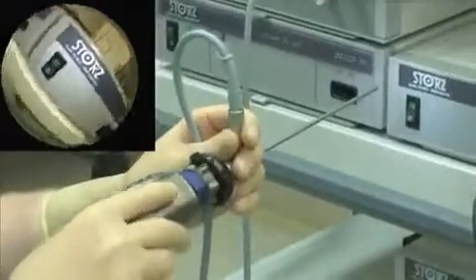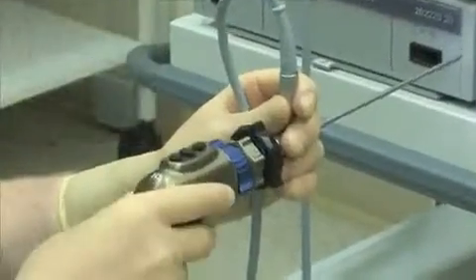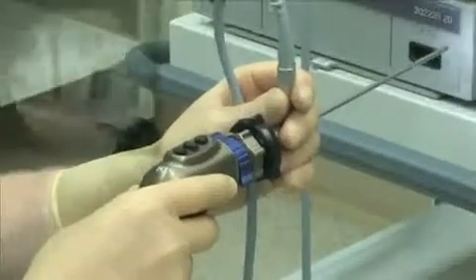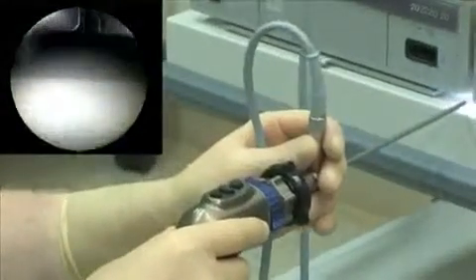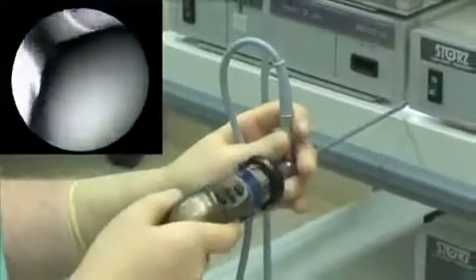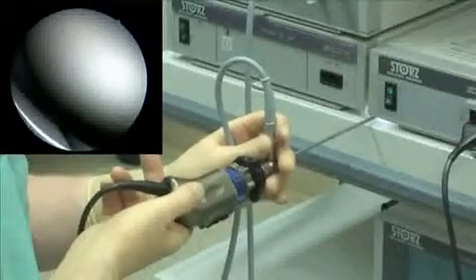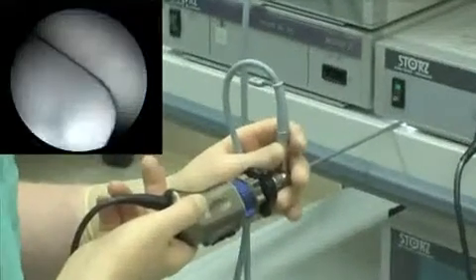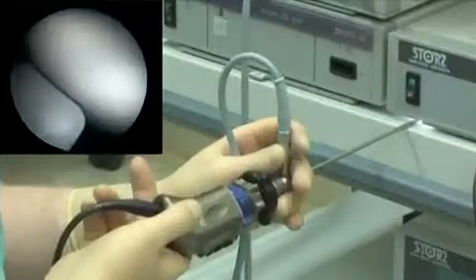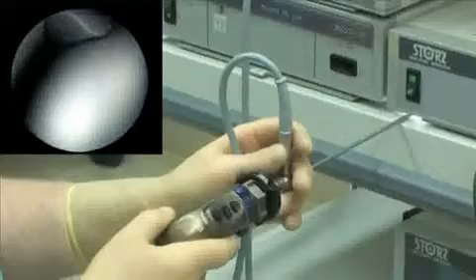In this case, if we have a sufficient field of view, orientation through the lettering on the arthroscopic tower is still possible. Camera rotation within a confined space is now shown. Turning the camera, orientation is totally lost. We do not know where we are. Retracting the endoscope does not provide any additional information, and only the correct camera alignment is helpful.